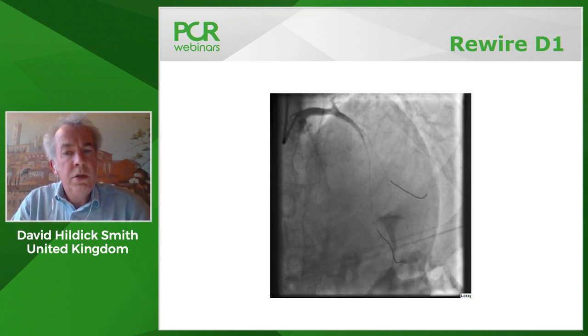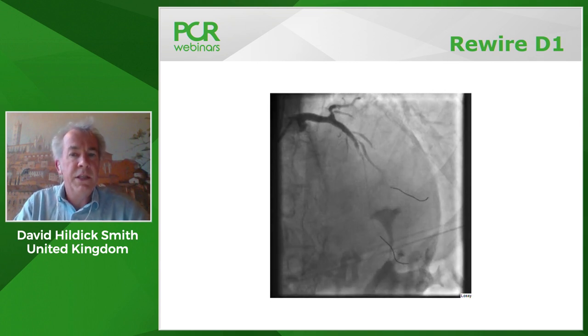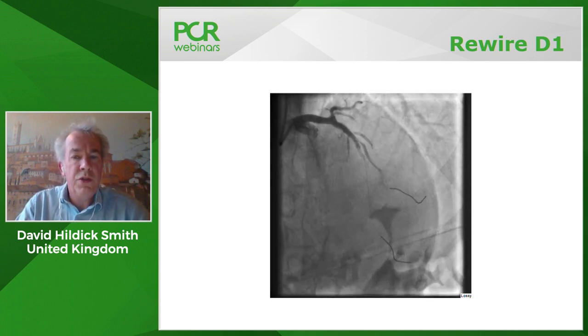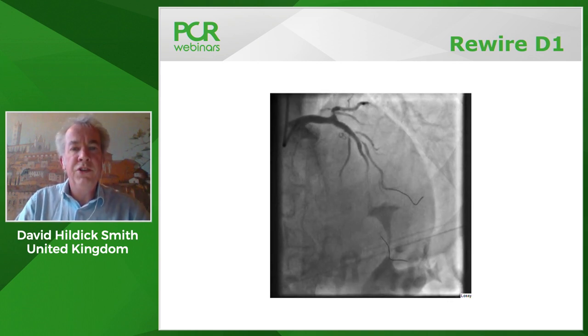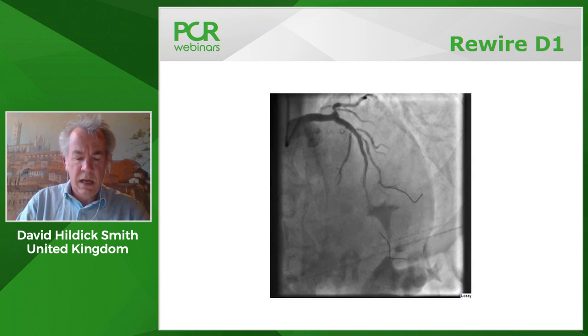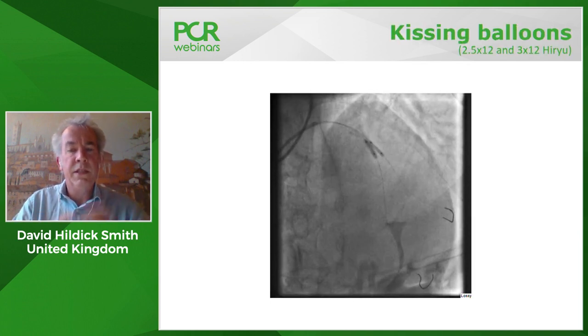So we could stop at this point if we really wanted to, but I think it's a sizable diagonal and it's quite pinched and perhaps could conceivably be an angina-creating vessel. So we then go on to do the kissing balloon inflation.